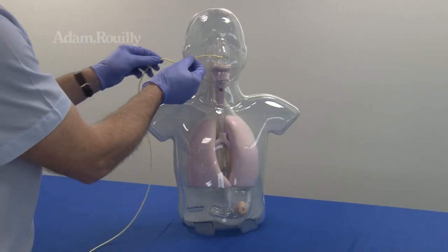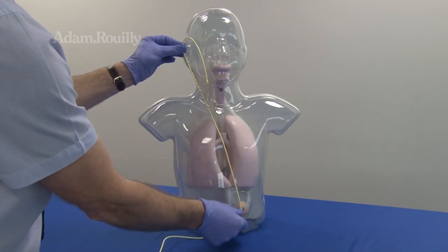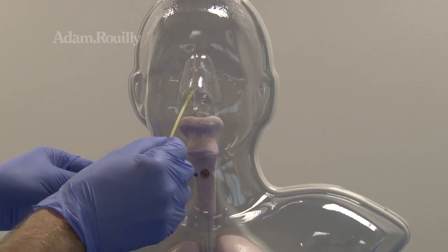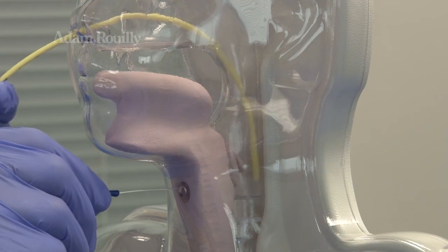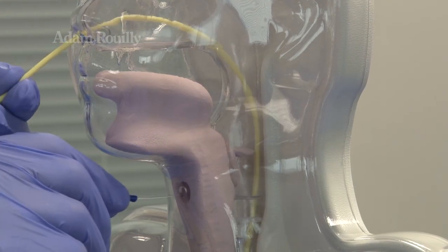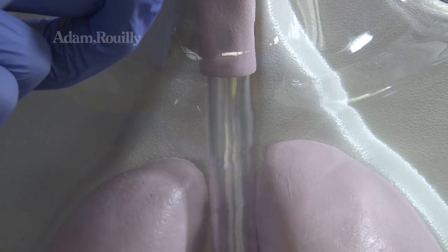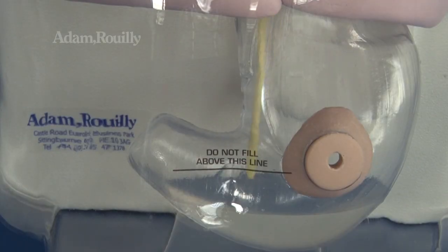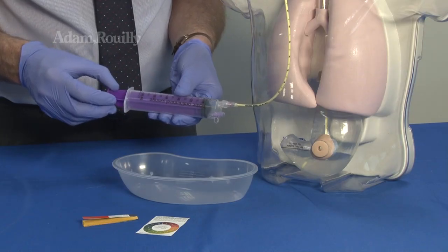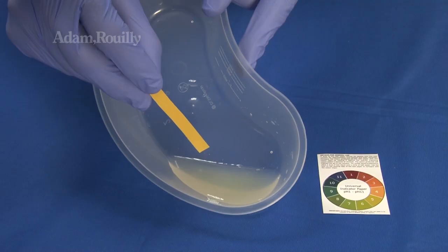During use, the nasogastric tube can be measured before insertion as on a real patient. The movable epiglottis simulates swallowing, whilst the transparent anatomy aids visualisation of the correct positioning of nasogastric tubes. Stomach aspirate can be withdrawn and pH tested to confirm placement.